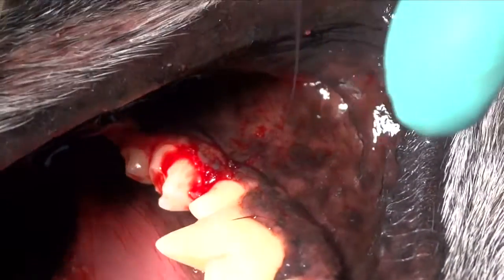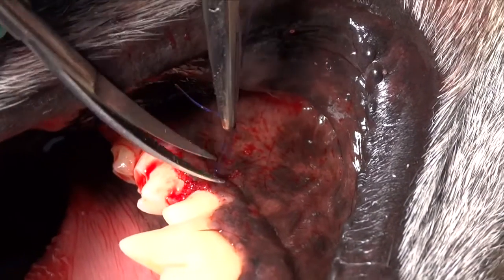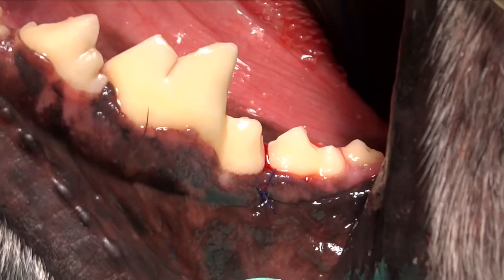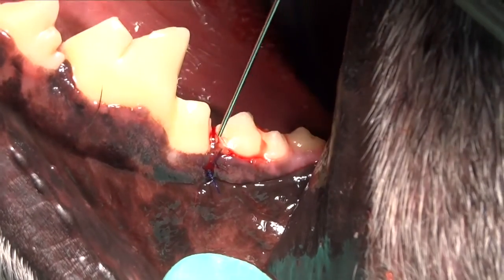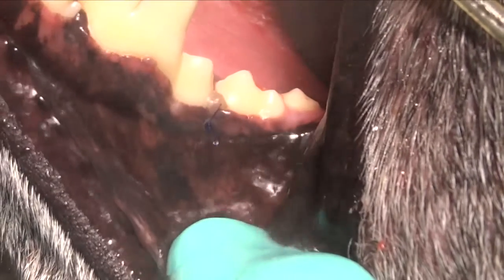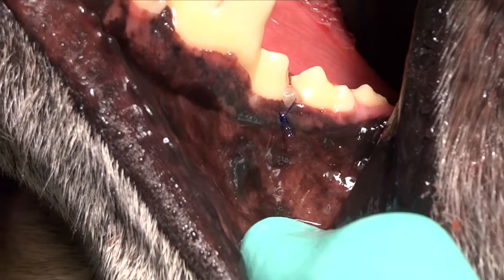If we leave that as is with the bone graft there, that's not termed guided tissue regeneration, but we can also use a membrane. In this case, we'll use Doxyrobe as a physical membrane to help block epithelial downgrowth into that defect. We're placing Doxyrobe into the defect to create a solidified material that will actually prevent the gum tissue from growing down into the defect and ruining our outcome. We place the Doxyrobe gel and use our air-water syringe to harden it partially.